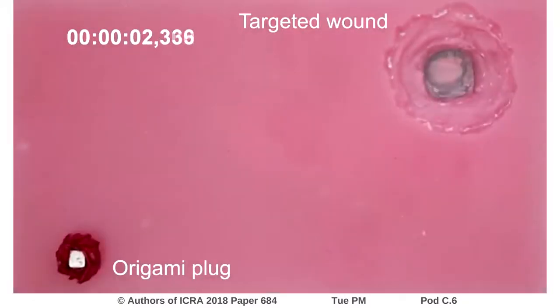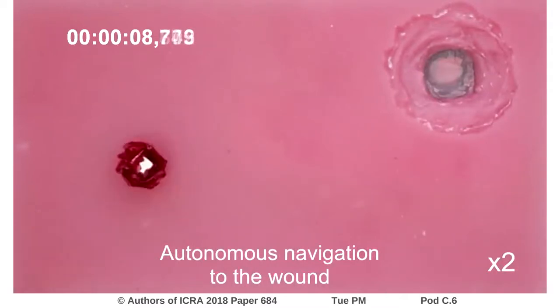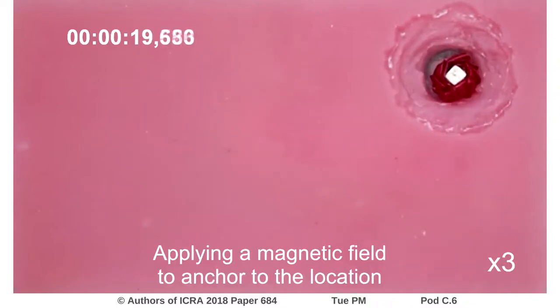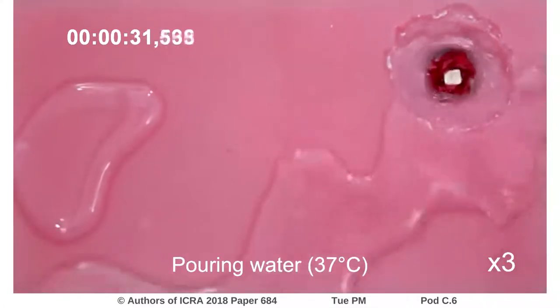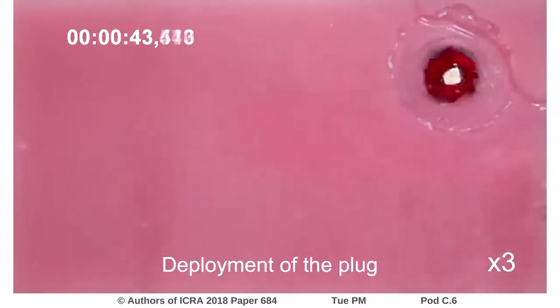Our second experiment shows the same autonomous navigation to a wound by rolling, but in this case the wound represented is much deeper, so it must be plugged rather than patched. The same field is applied to hold the robot in place as warm water is added. The structure unfolds and expands to plug the wound.